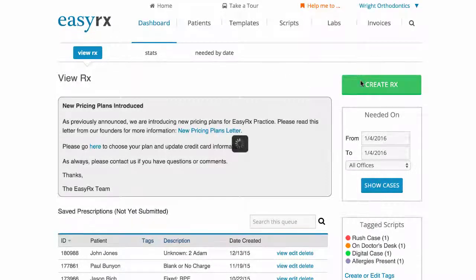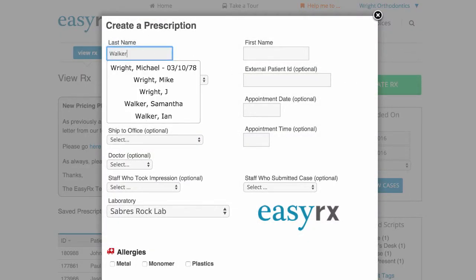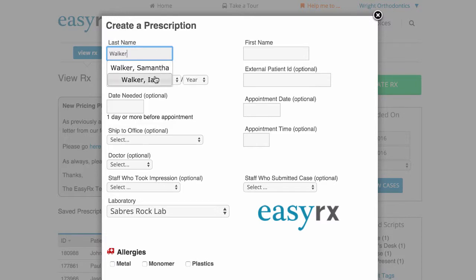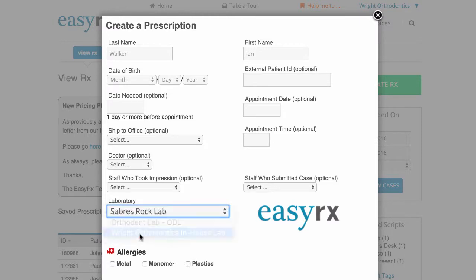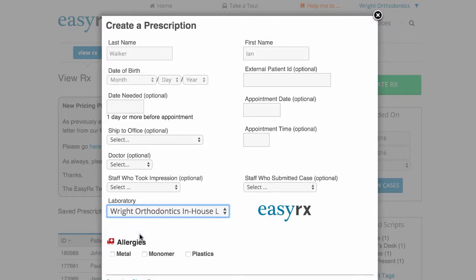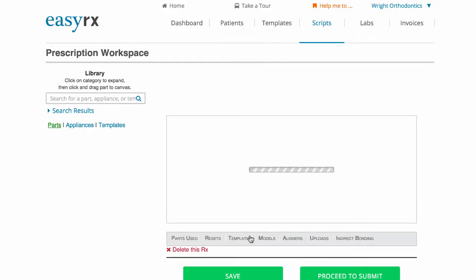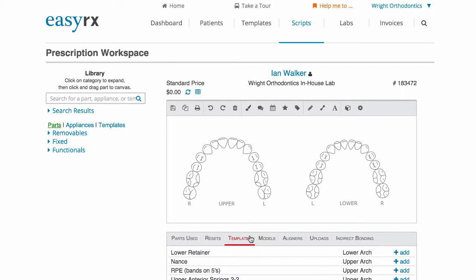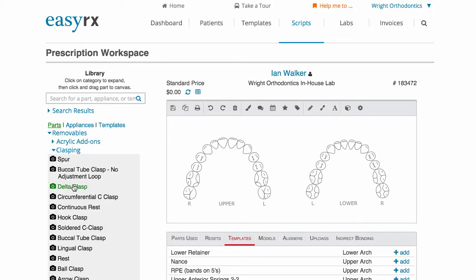To begin, from your dashboard click the green create RX button. Fill out all the necessary patient and location information, then scroll down to choose your in-house lab from the lab list. On the workspace, begin by clicking and dragging parts from the library on the left to graphically design your RX.